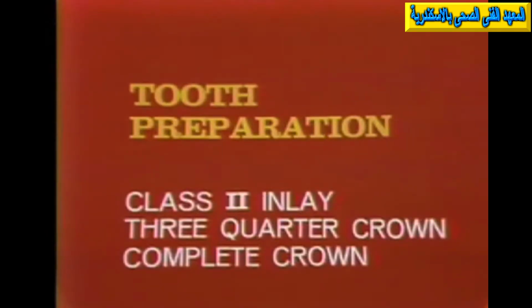Similarly, if a 3/4 crown is being done, then it may be important to make sure the design includes a box on the appropriate proximal surface and that the box is both wide enough and deep enough to accommodate the keyway in the gold casting.